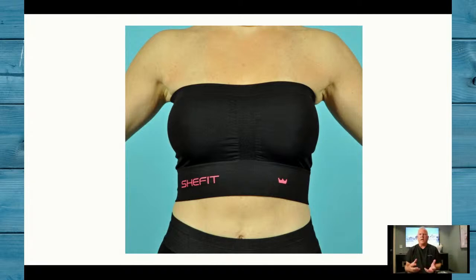It's a very elastic, supportive surgical sleeve that is applied, and we actually put this around the patient's waist or legs, and then when we're done with surgery, we just lift them up and slide this up. It takes literally five seconds to get it up in position, and then we can get the patient safely out of the operating room into recovery.